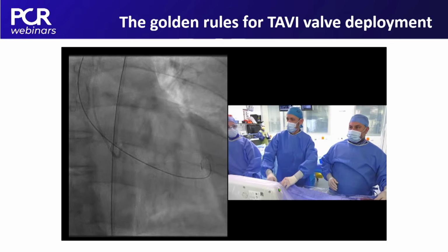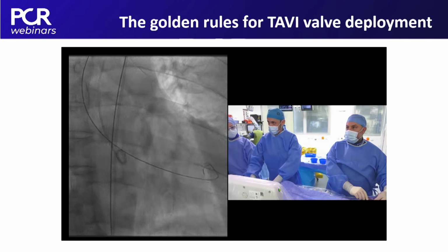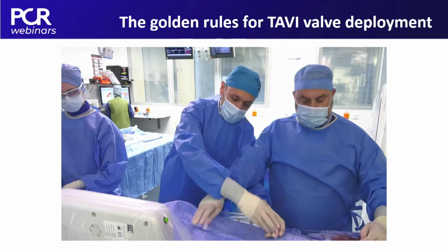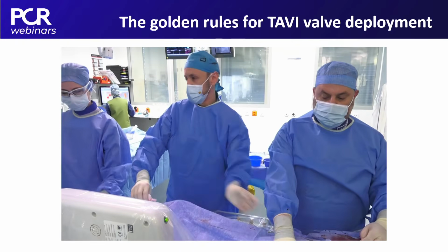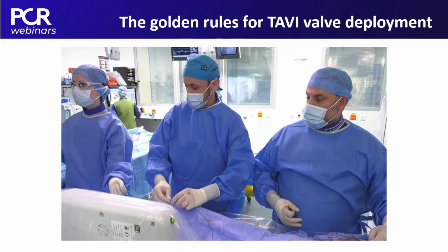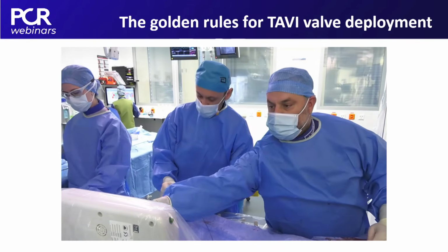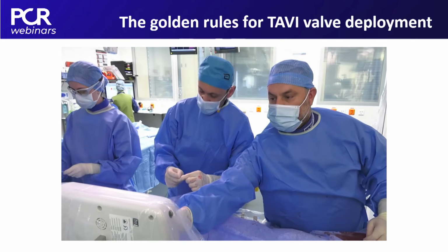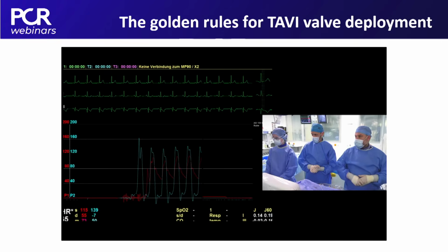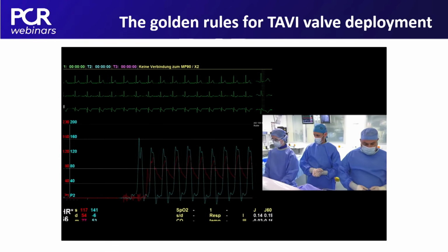As you may see, there are stents in the coronary, so the patient has coronary artery disease. One of the reasons to choose the Navitor valve is that you can do commissural alignment, and if you cannot do it because you don't see well or because there is a lot of tortuosity, you have anyway an intra-annular valve that allows easy access to the coronary, together with the large dimension of the stent cell frame. Here you can see the hemodynamic trace showing the severe stenosis.